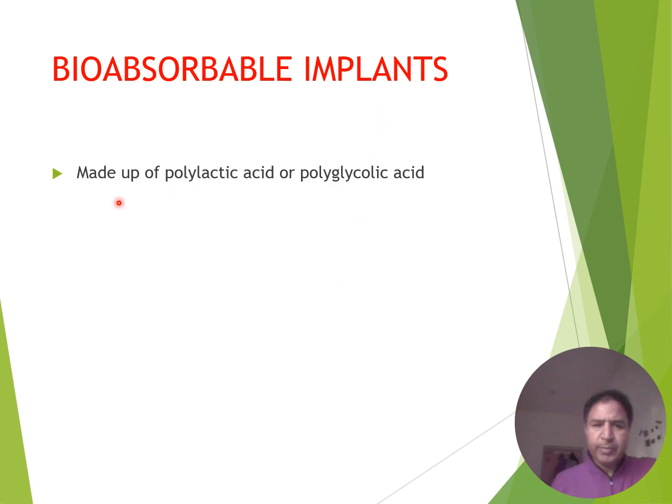Bioabsorbable implants made of polylactic acid and polyglycolic acid.